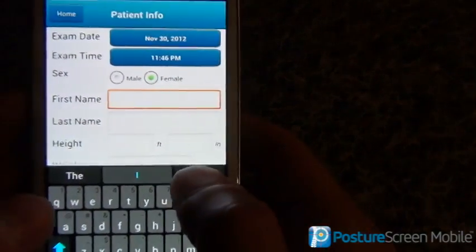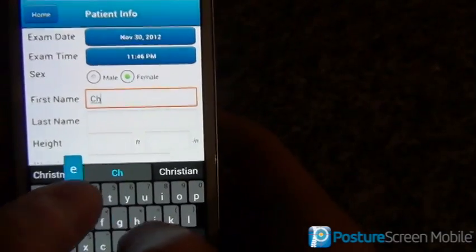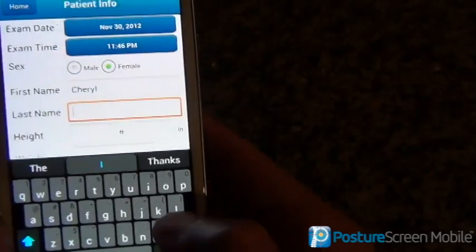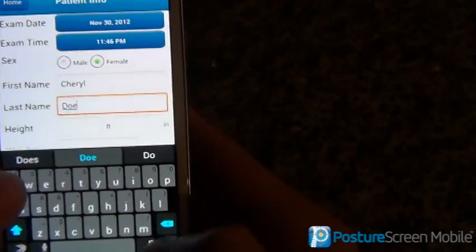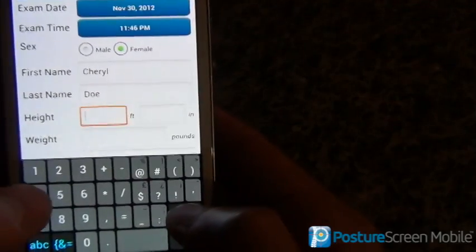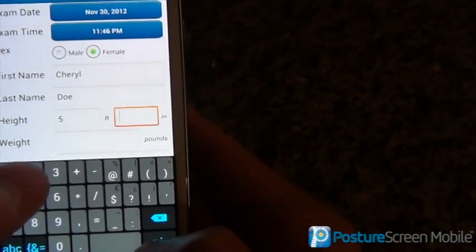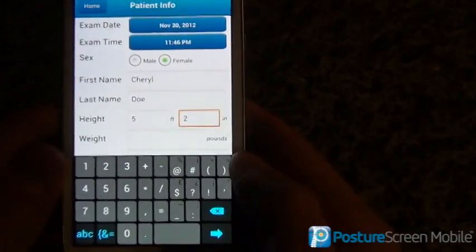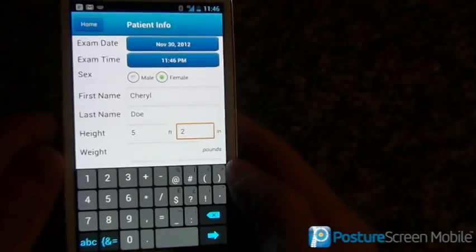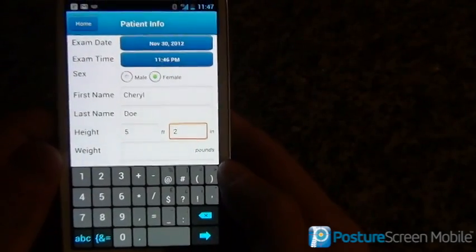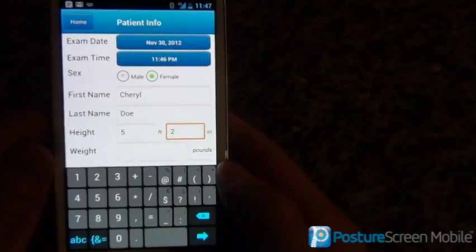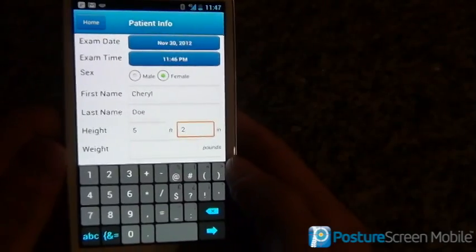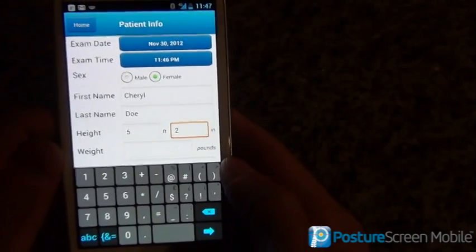I always use the default name Cheryl, and let's go ahead and put Doe as her last name. She is 5'2". Something you should know is that each Android keyboard is different. Unlike the iPhone, with Android you can pretty much install anything you want, so your keyboard and your mileage may vary based on the Android device that you have.